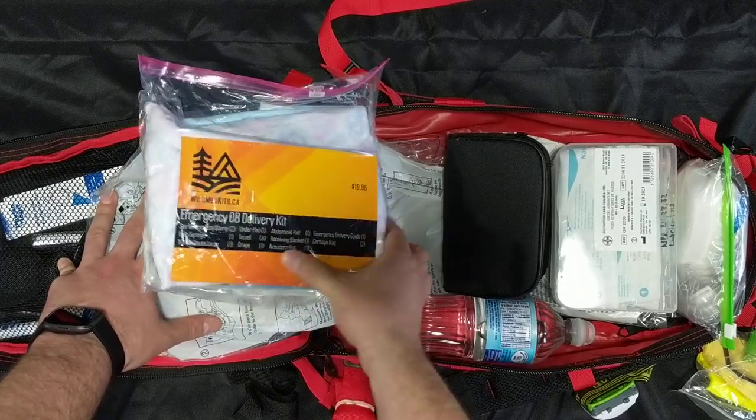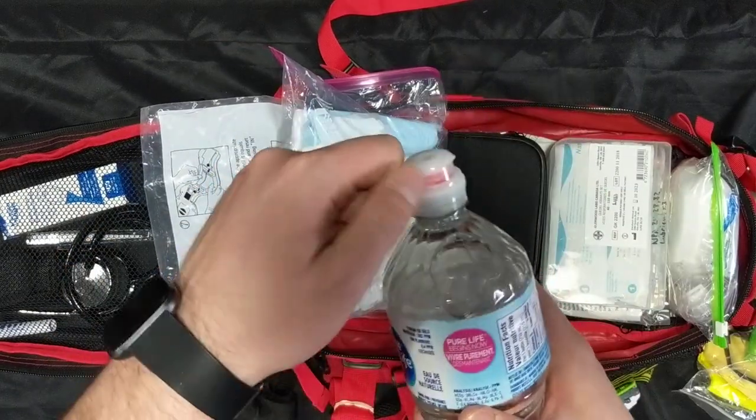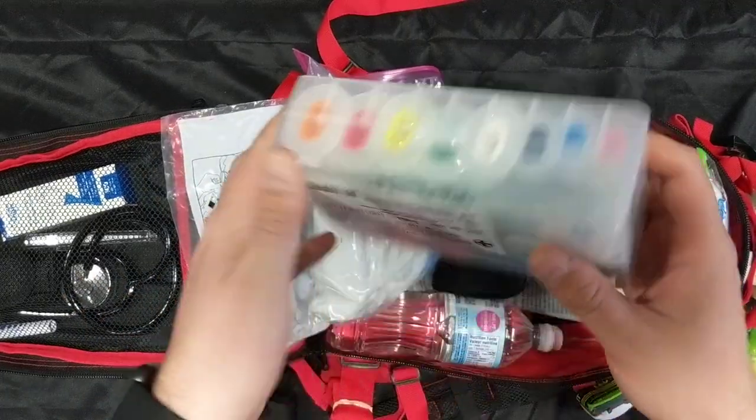This is a full obstetrics kit for emergency childbirth — it's got everything you need in there. You also have a blood pressure cuff and a large water bottle with a sport cap for irrigating eyes and wounds, as well as for hydration if a patient is dehydrated.